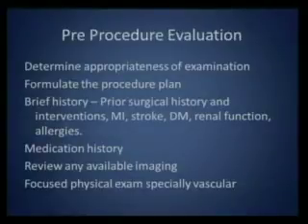Review any available imaging. Before you start a case, majority of times if you see the prior imaging, it's very helpful to plan what you want to do. The worst thing is you start a procedure and then realize that, oh, I missed something and it was there on the prior imaging. So prior imaging, it could be a CTA, it could just be a CT, it could be a duplex ultrasound. Whatever imaging is available, always look at it.